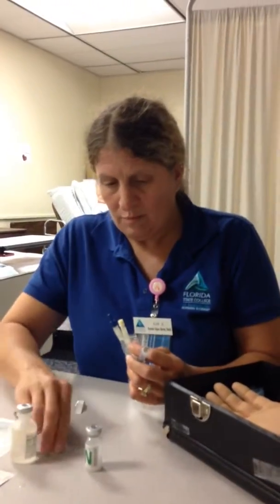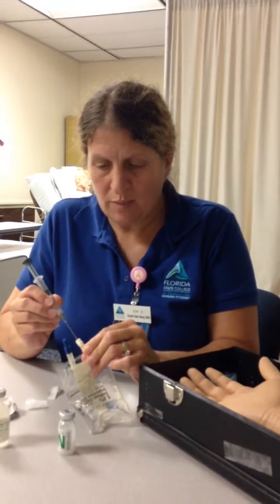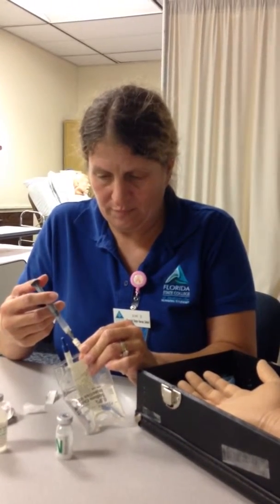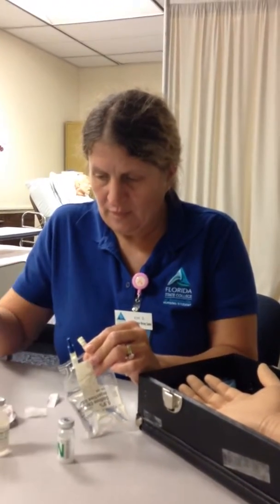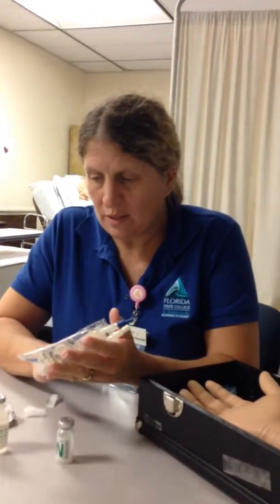The time, the date, the route. I am going to wipe off the IV site just to make sure, and I'm going to inject the 2 milliliters of the drug, the Flagyl, into my 100 milliliter bag. I'm going to dispose of this into the sharps container, and I'm going to mix in my bag. Then I'm going to label my medicine with the drug name, the dose, the client's name, the time of administration, and my initials.